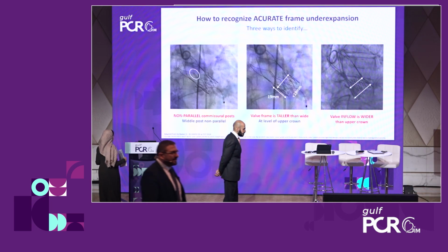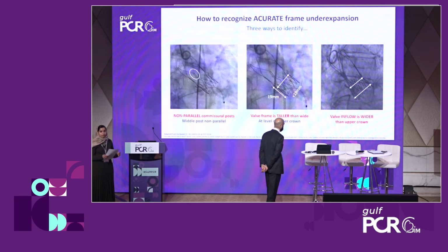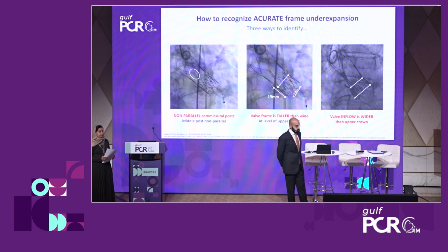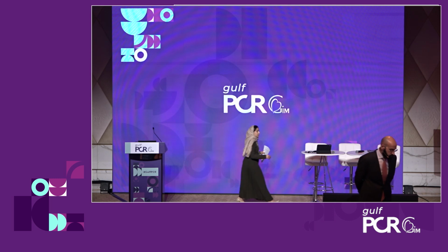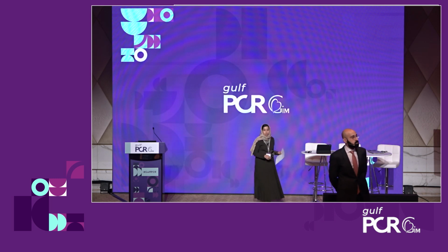For severely calcified patients or valves, I think ACURATE neo may not be a good choice, because even with pre-dilation, maybe you don't have enough space and maybe it pops up afterward. I agree. Probably you want to use the strongest radial force you have, probably balloon expandable or Evolut in those kind of scenarios.